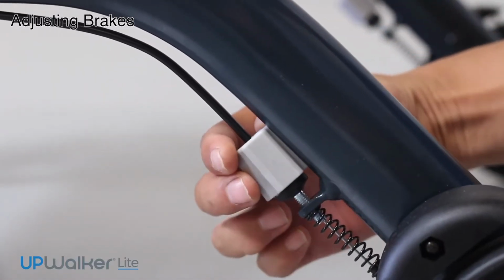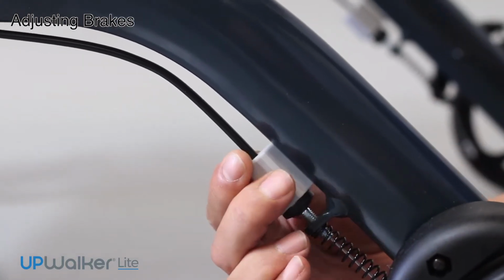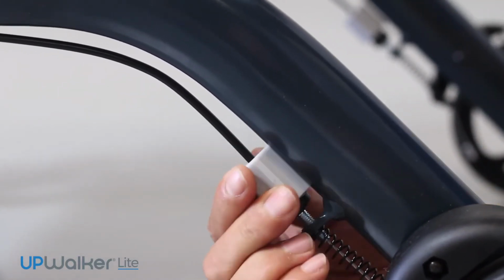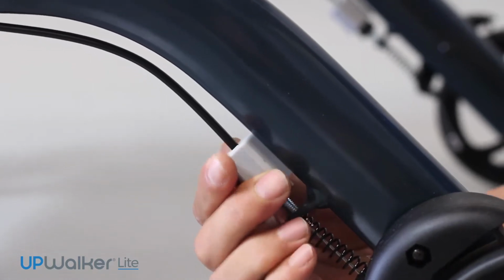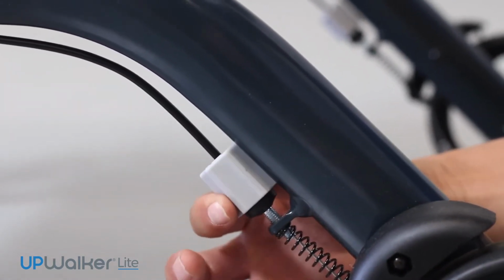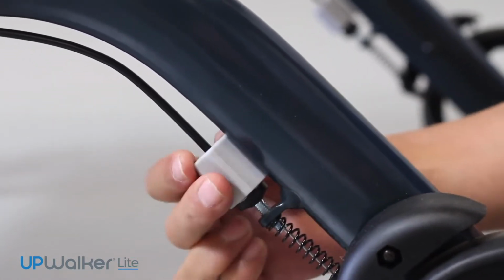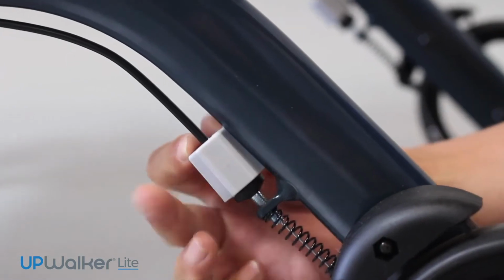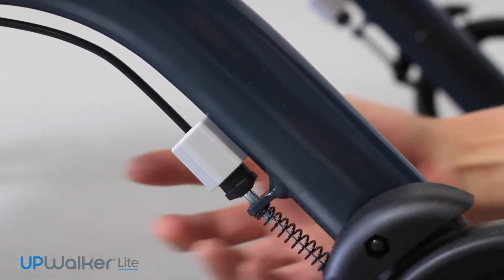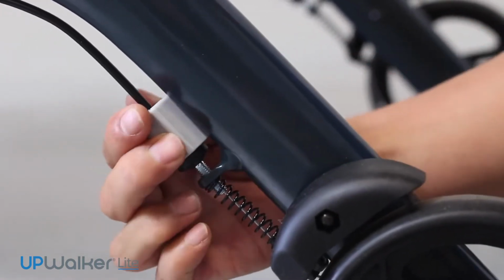Next, I'm going to discuss the adjustment of brakes depending on whether they are too loose or too tight. Using your fingers, reach down towards the rear wheel, grasping the gray knob. You will note that the gray knob is spring activated and you need to push it towards the wheel in order to activate the nut retention.